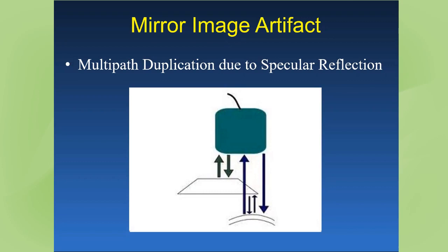We start on the left-hand side of the illustration. We see the transducer sending down ultrasound, bouncing off the anterior mitral leaflet, or reflecting off of it, and returning to the transducer. The echo machine says, well, I know the physics behind the ultrasound that I'm sending out, and I know it took this amount of time to come back to me. Therefore, I know the distance. And it places the image at the appropriate distance, demonstrating the mitral valve.